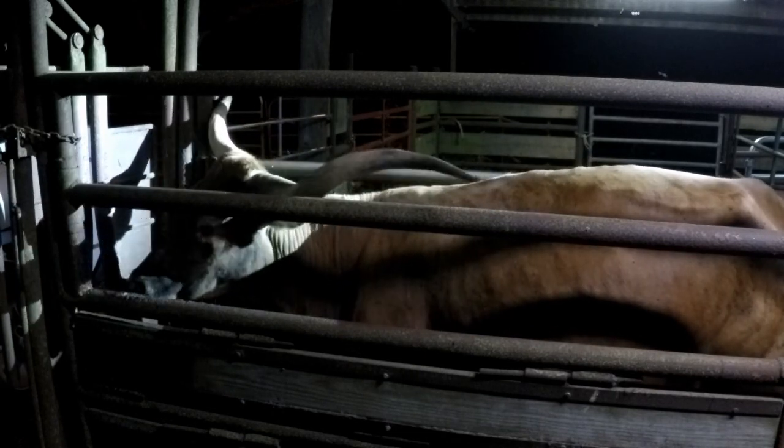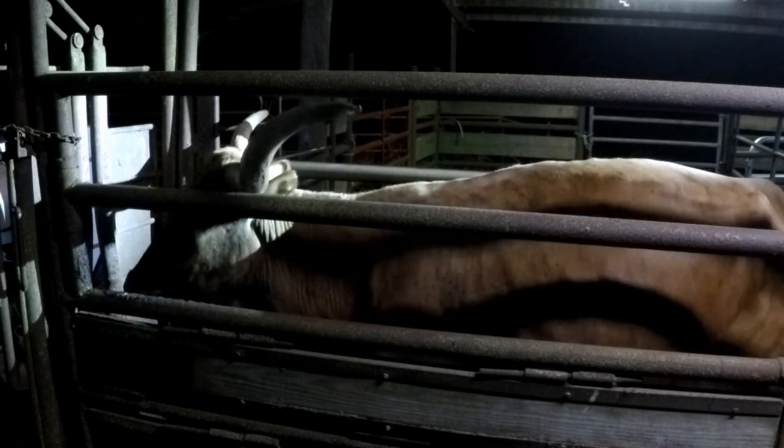Okay. Now, I'm just making sure I'm in the right place, releasing the semen. And now, we're going to go check the semen right quick on the microscope.